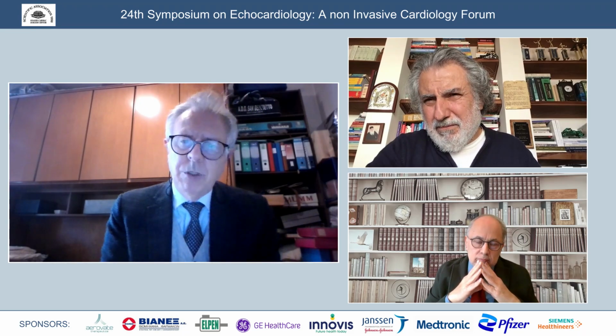What we have tried to change in my hospital is to reconsider antithrombotic agents or warfarin after bioprosthesis, because we have seen this problem in several cases. Obviously, there is nothing scientifically determined. Anyway, I think that subclinical thrombosis, or even some cases of clinical thrombosis, are more common than we generally think.